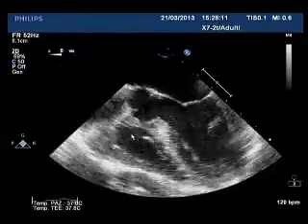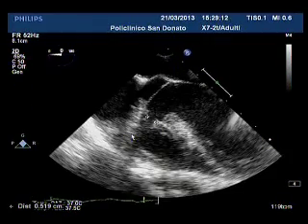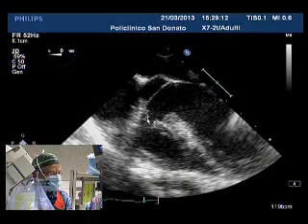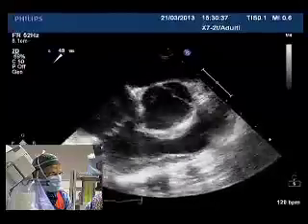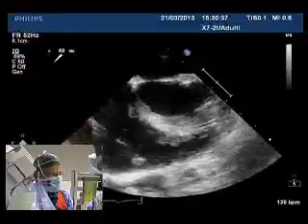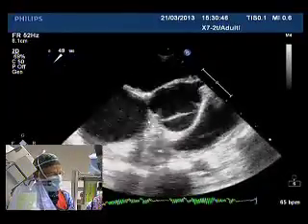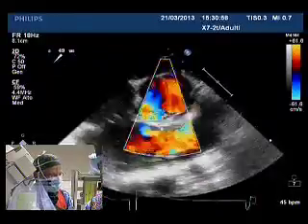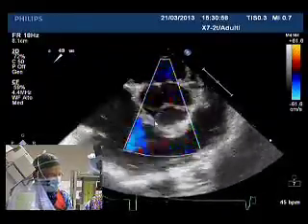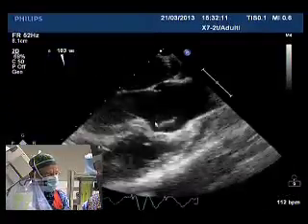Little aneurysm of the atrial septum. We measured it, and we got a measurement between 5, 5.5 to 6. As you can see here, here is measure 5.19. There is a little aneurysm, exactly as Carlo described before. Equivalent to a short axis, nice aortic valve, very, very mild prolapse of the right coronary cusp into this defect. As you can see here, no significant AI in any way, shape, and form. And another view of the same.